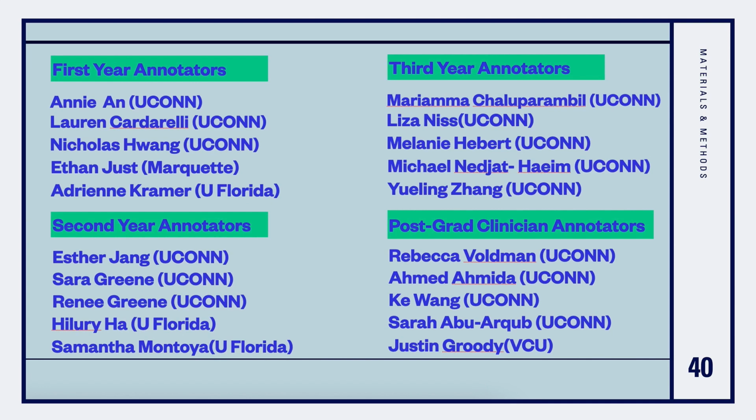And then finally, to gauge where the algorithm performance ranked relative to clinicians, its error was measured relative to 4 levels of orthodontic providers. These levels were first, second, and third year orthodontic residents and orthodontic providers practicing in a postgraduate clinical setting. 3 calibrated orthodontic annotators from the study determined the true location of each landmark, and the same 30 x-rays were annotated for each group. The model then traced the same 30 images for comparison. So I'd like to give a huge thanks to everyone who donated their time and participated in this.